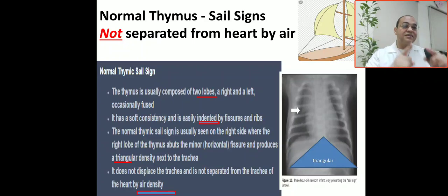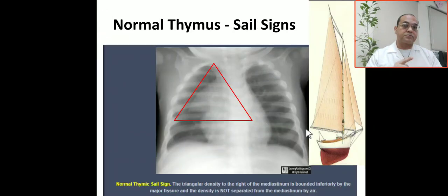The thymus is not separated from the heart or mediastinum by air, and the thymus is not displaced superiorly or laterally from the heart and mediastinum. This is the normal thymic sign — the base of the triangular thymic opacity is not separated from the heart or mediastinum by air, and the thymus is not displaced superiorly or laterally.